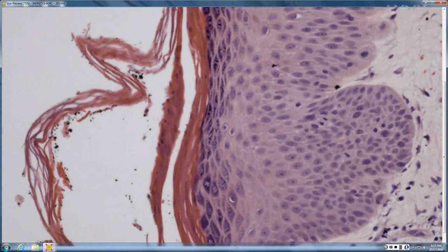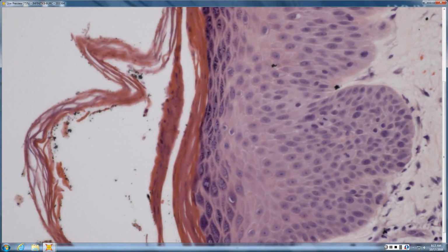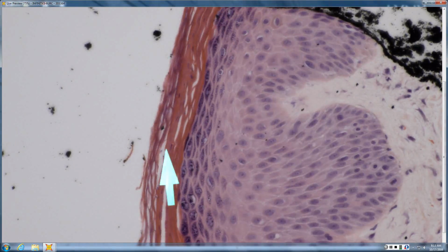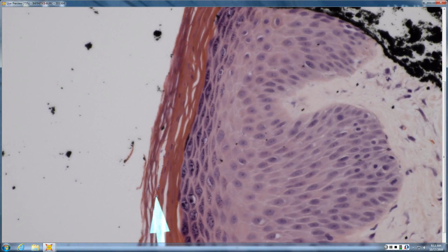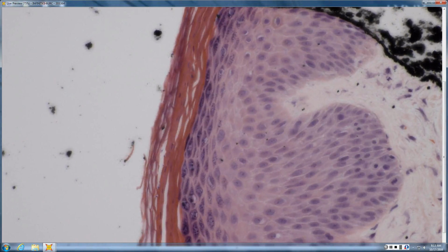And you see a little white space there in the corneum. See that little circle there? At the junction between compact and flaky? Right in there. Nice. Caught me in action. That's often where they live. They typically live within that compact corneum, sometimes at the junction of that and the overlying corneum, more commonly towards the bottom of the compact corneum. But anywhere in that compact layer is where they can be found.